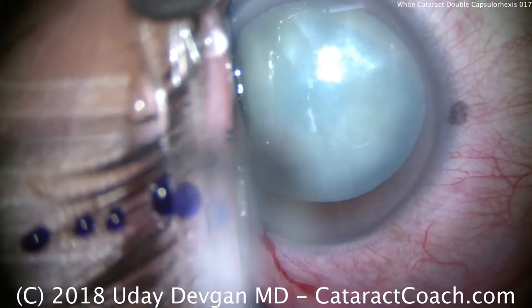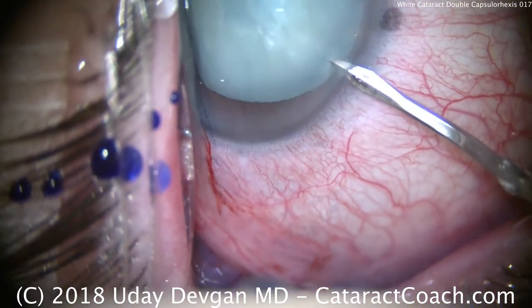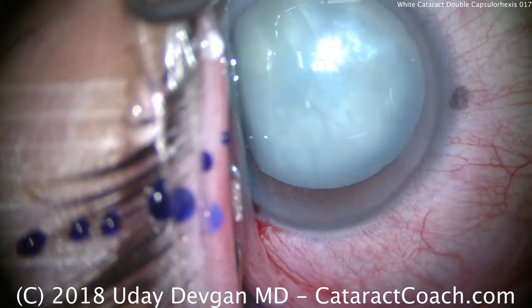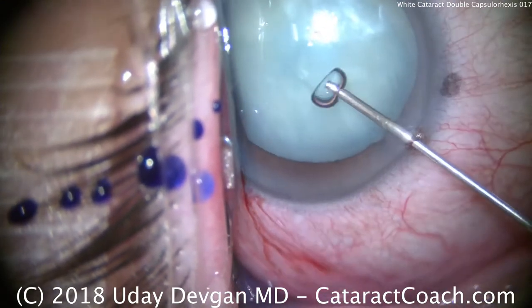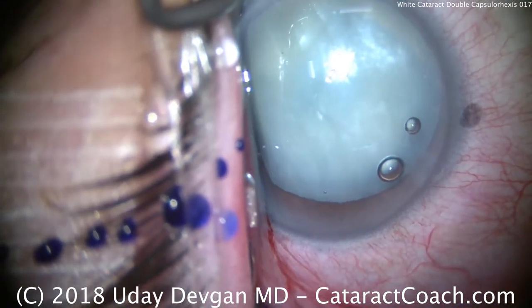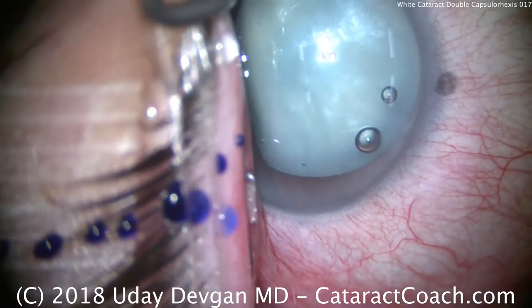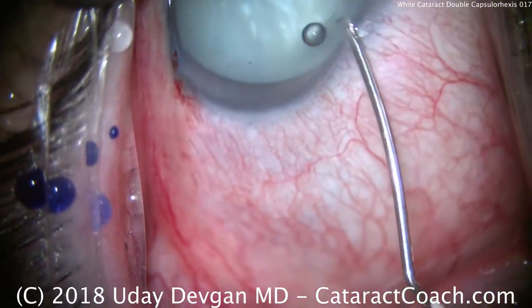We're going to make a second paracentesis here. There's our second paracentesis. Now remember, the anterior chamber is highly pressurized here. We're going to put a little extra viscoelastic. We want the AC pressure high — higher than the intralenticular pressure — so an AC pressure of probably 40 or even 50 millimeters of mercury.